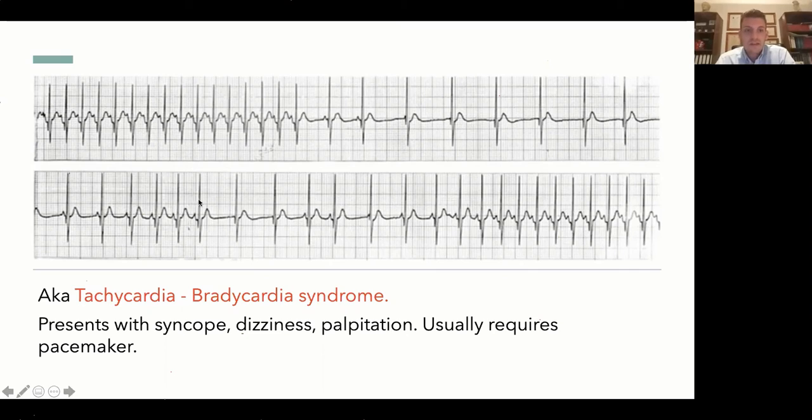Because you can see, can someone tell me what the rate is right here, where I will draw, okay? The rate here, what is the rate here in this segment? And what the rate is here. See, this is an irregular ECG with 2 separate regular parts, okay?